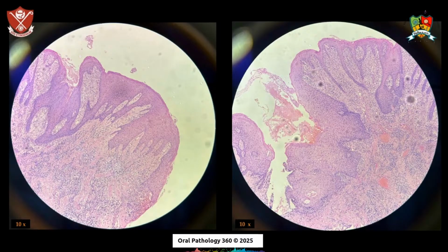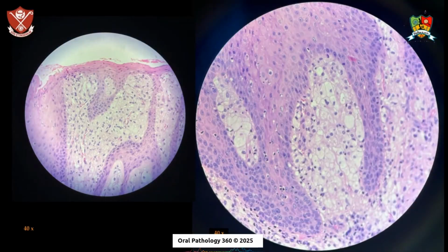The histopathology showed hyperplastic parakeratinized squamous epithelium. The papillary projections were seen with elongated rete ridges of relatively uniform depth, and parakeratin could be seen filling the clefts or the crypts between the epithelial projections. The hallmark of this lesion was the presence of numerous large macrophages with foamy cytoplasm, typically confined to the connective tissue papillae, extending high into the papillae close to the surface.